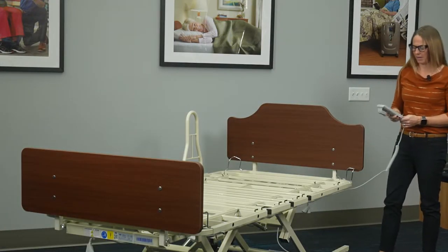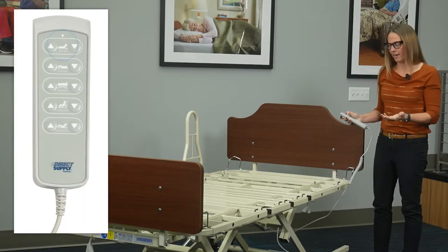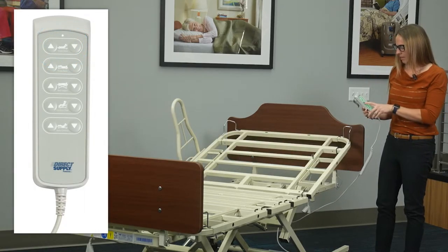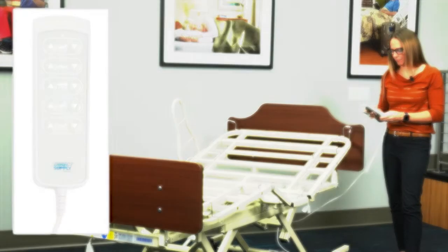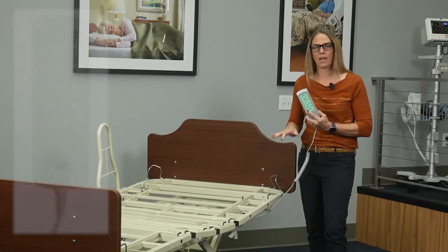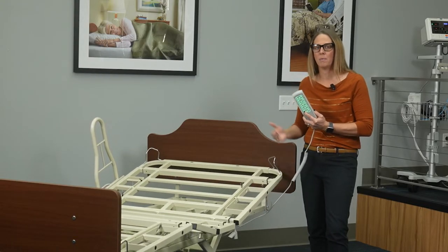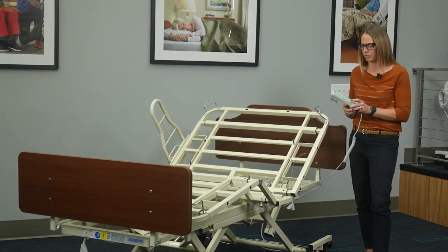Let's talk about the functions of the bed. Like most electric beds, this will have head up, knee up, and of course the high-low function we already looked at. This bed also has an auto contour button which is going to move the head and knee decks at the same time to help prevent a resident sliding or shear forces on the resident during articulation.